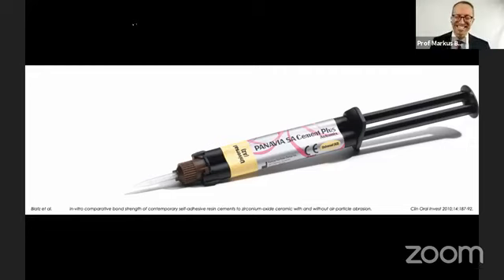Thank you so much. As I mentioned before, because ceramics are so dependent on thickness and strength and maybe reinforcement, the use and selection of your cement is very important. What we recommend is, for a conventional crown with appropriate thickness and good retention, you do not have to bond zirconia. You can use conventional cementation. You can use resin-modified glass ionomer, glass ionomer, or also self-adhesive resin cements.